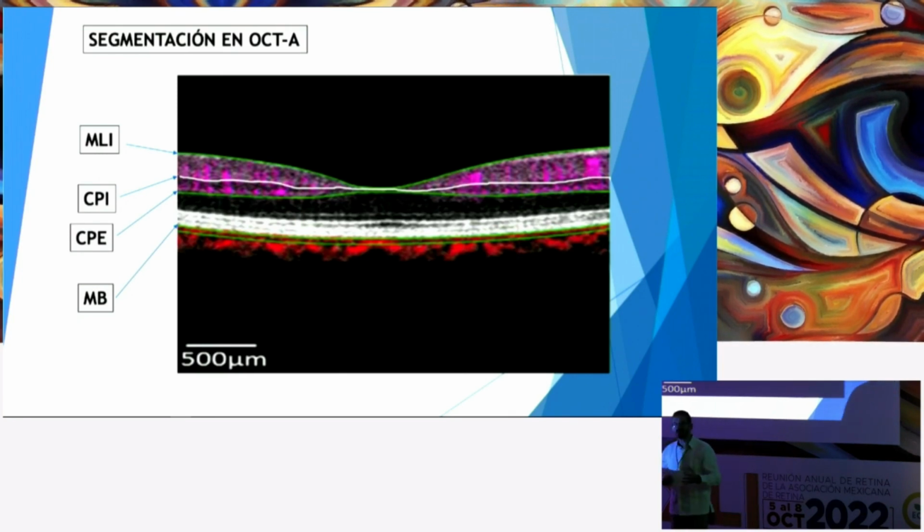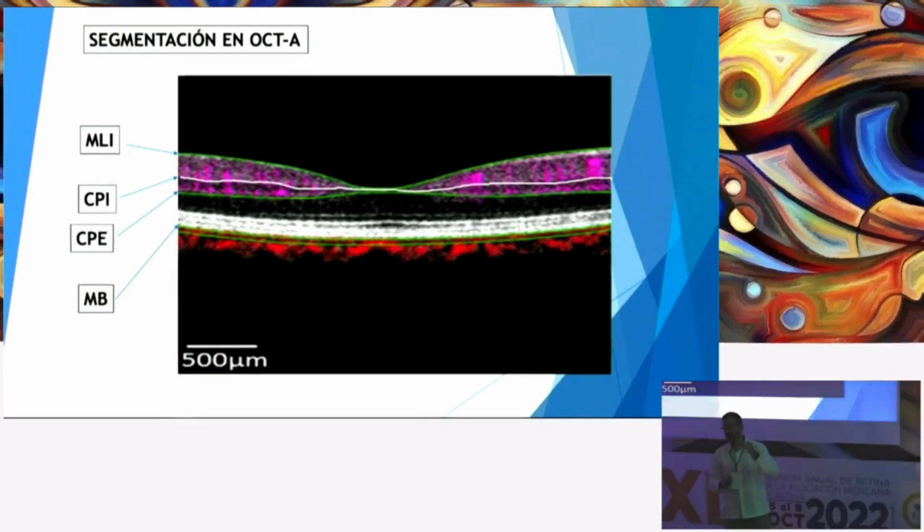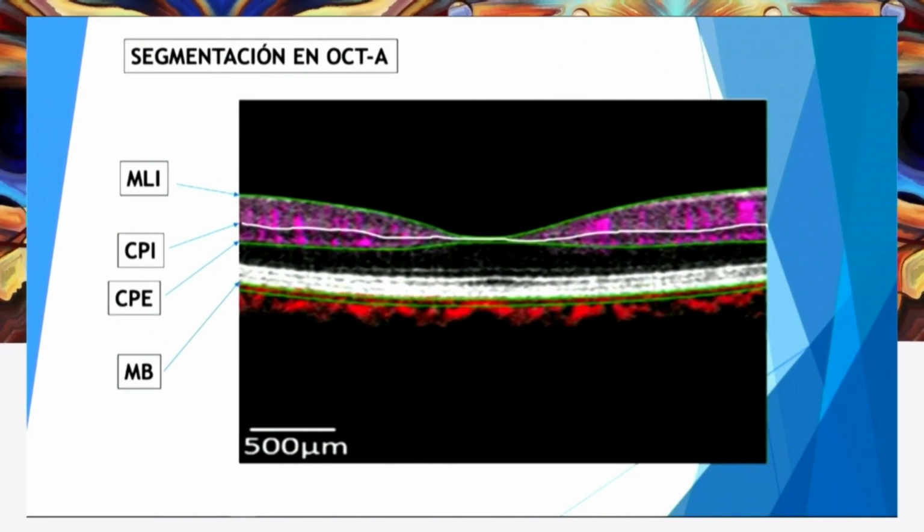Dr. Garnica told you how the machine generates a segmentation on retinal layers on the macular area. It makes cuts or slices showing us what we want to see. She said that not all areas are sliced because that is not that relevant for our exploration, based on what we want to know considering our patient's pathology. We have to focus on segmentation areas: the internal limiting membrane, the internal and external plexiform layers, and Bruch's membrane.